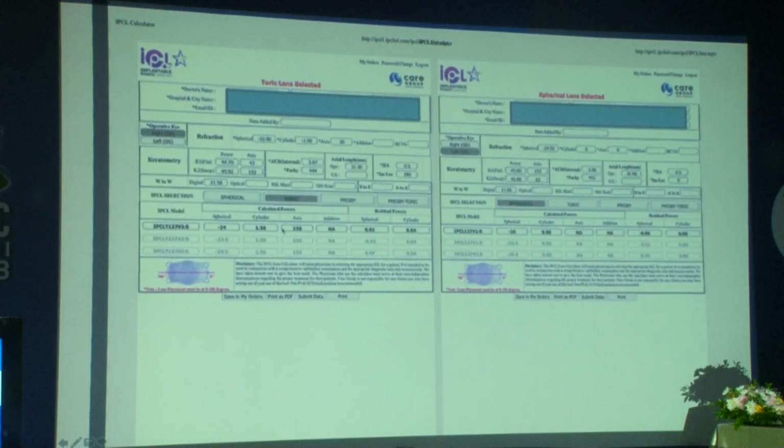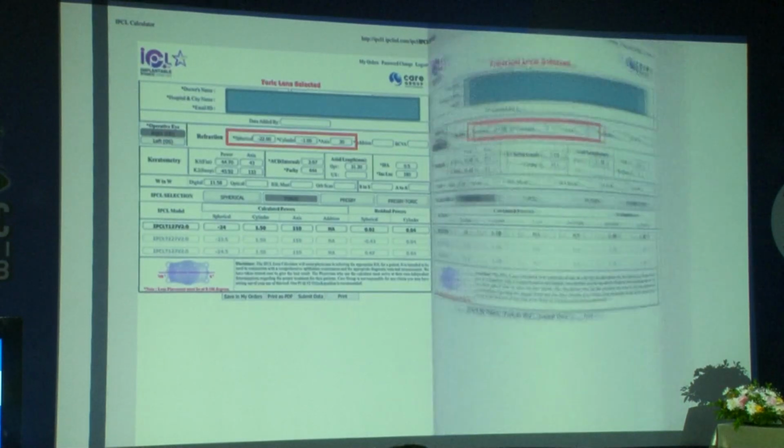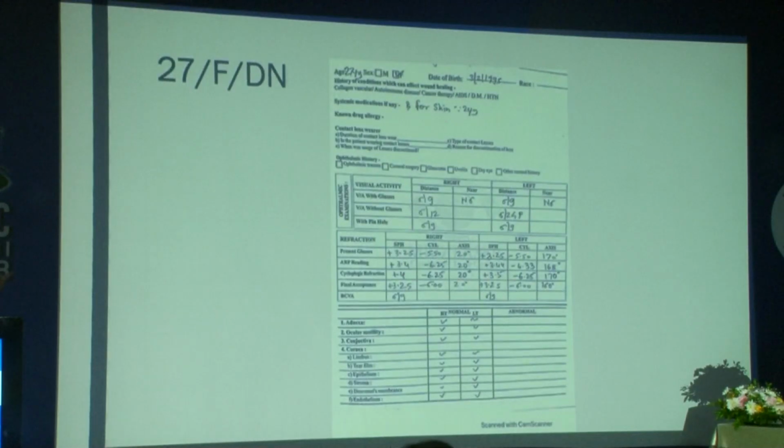So what if the refractive error of your patient is -22, as is seen over here, I think 22 and 24. Or also I had this case with mixed astigmatism, and I actually have a refractive center where I do quite a bit of corneal lasers and SMILE, but mixed astigmatism is definitely one of the categories where I will tell the patient that you will have a residual error, you may have regression, you may need retreatments. With retreatments, there's risk of epithelial ingrowth.